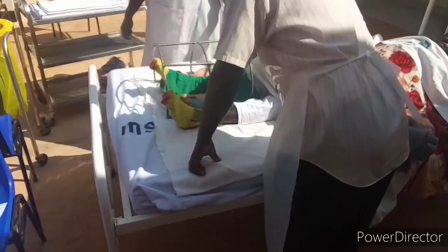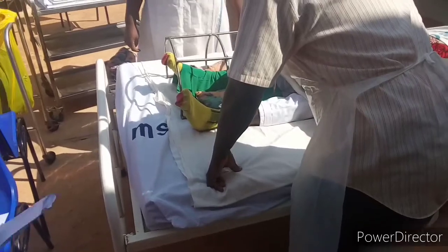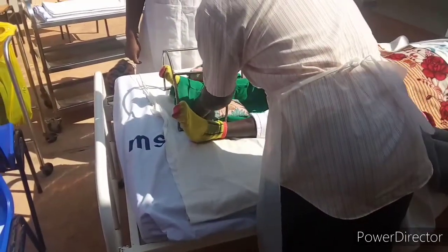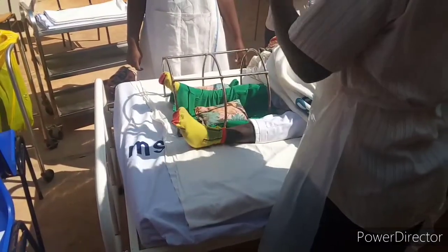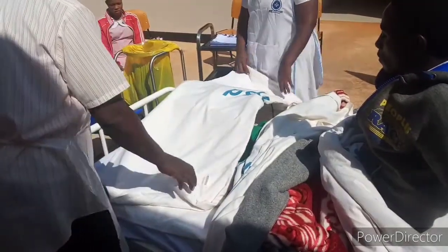That is a sterile dressing towel which is being supported by the sandbag on both sides, in order to avoid the squeezing of the leg. As you can see, there is support from that side and on this side, so the leg is protected. That is the bed declared.